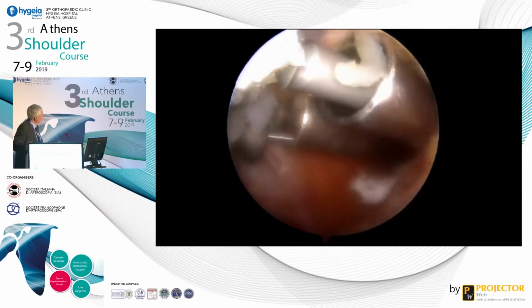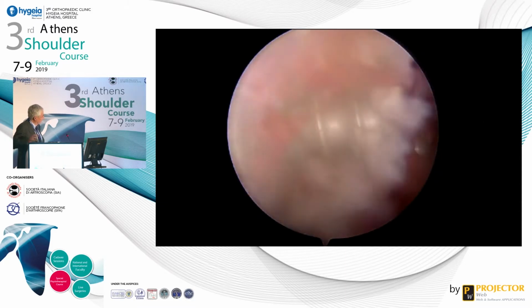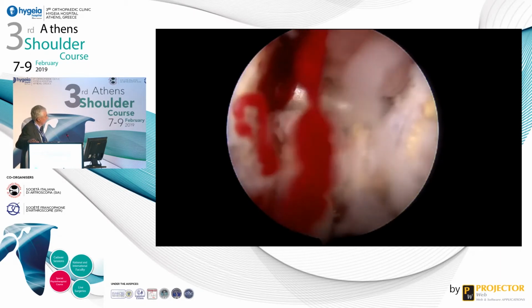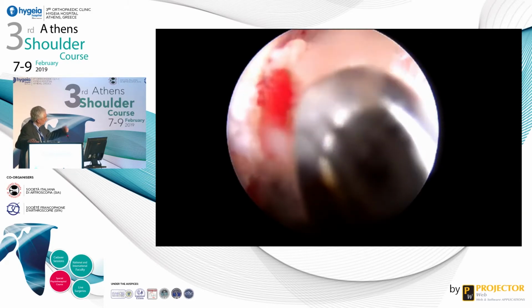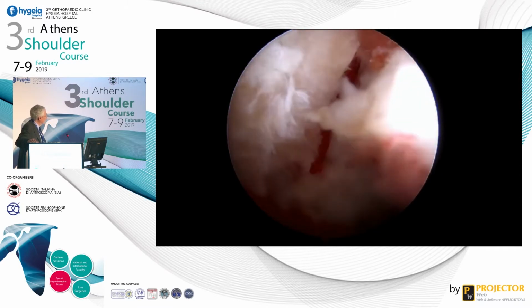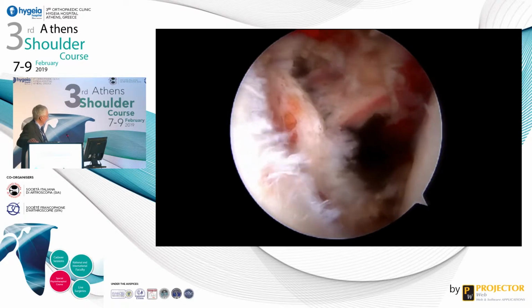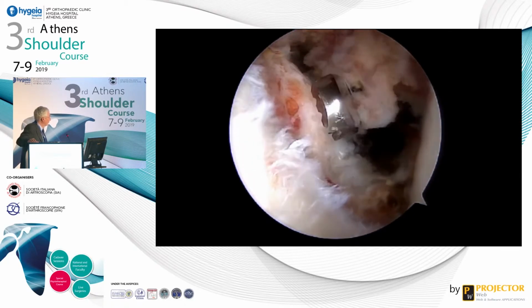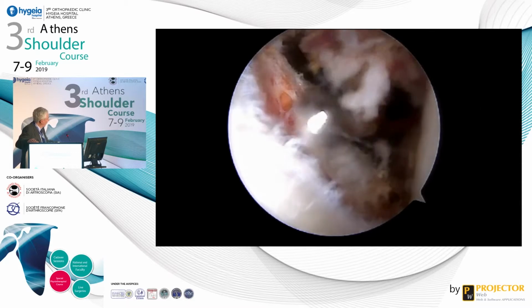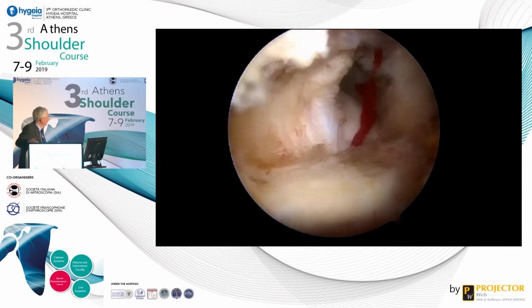I use a Di Giacomo plate to reinforce the fixation of the coracoid process, and after, with the switching stick, I move the subscapularis down. Like the Chinese group describes, I elevate the upper part of the subscap with the drain, and I can move the coracoid process with a screw, and I fix it to the glenoid side. We can check from the back, and if you have some bone to overhang, you can resect it with the power rasp again, and you finish.